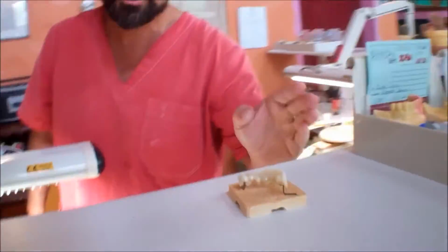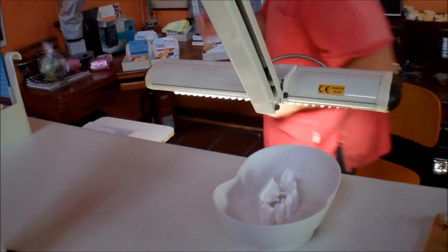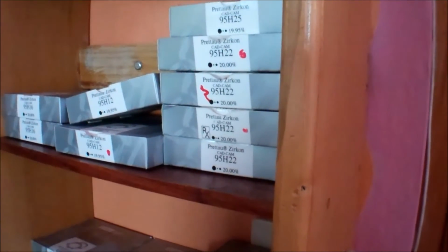It is other patients, several patients. So from the milling machine it comes out in this way, about 22. It depends on the block. So you see here, about 20% bigger when it comes from the machine. You can see here, this is 19.95, this block is 20. Oh, I see. It depends. Each block has its exact inspection, you know.